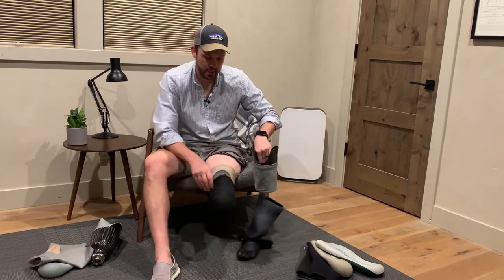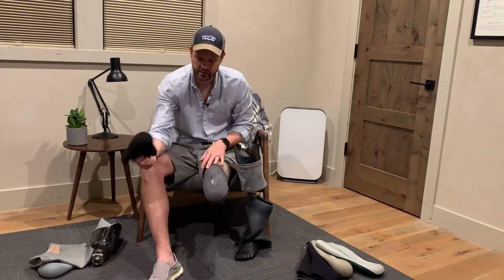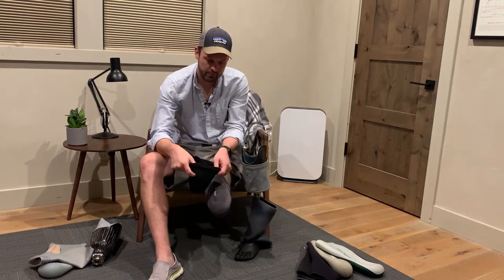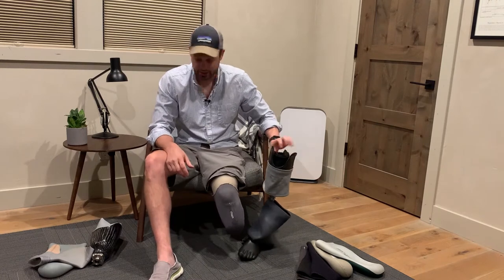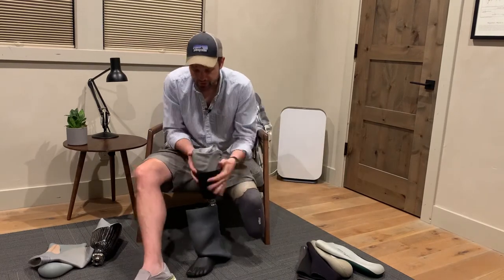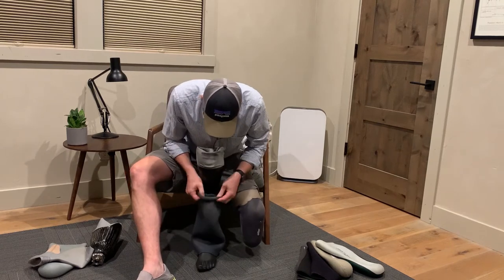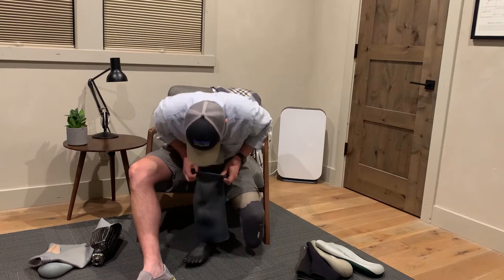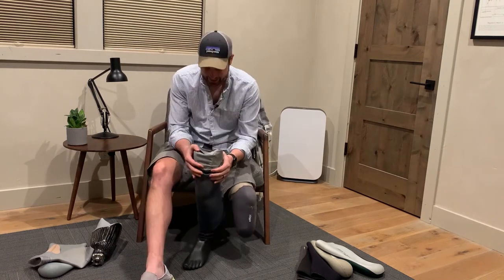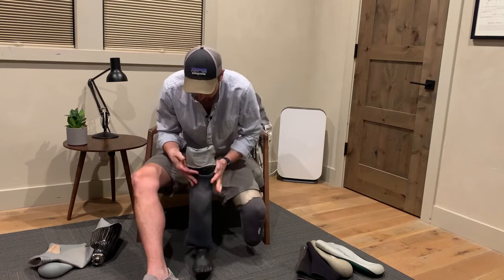So then it comes off — no pin or anything. I have a bunch of socks on in this case because this is an older socket and my leg has shrunk, so the socks fill up the extra space in the socket. This sleeve is pretty long, which is what I prefer because they stay on better — you get more connection, more surface area, more coverage.